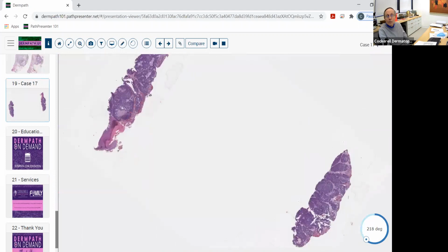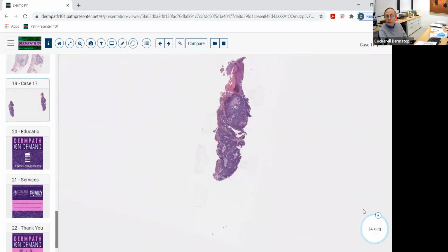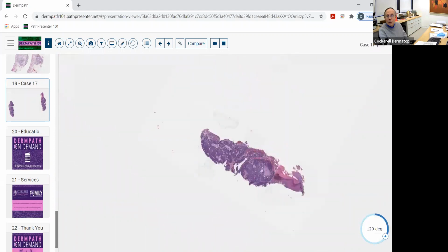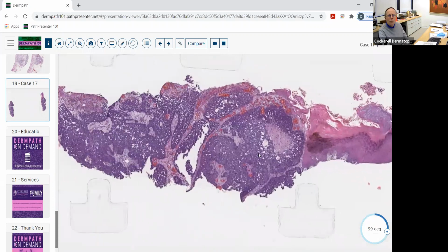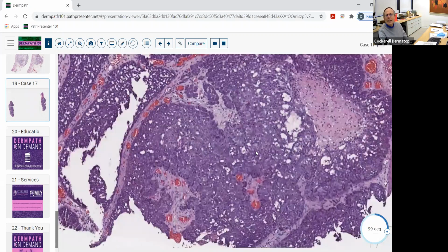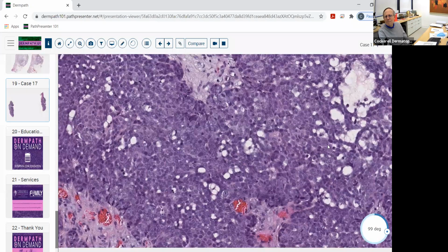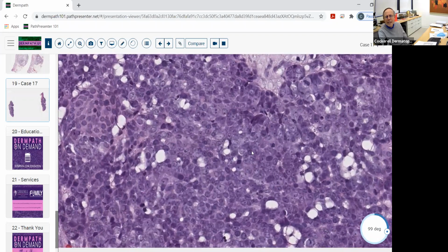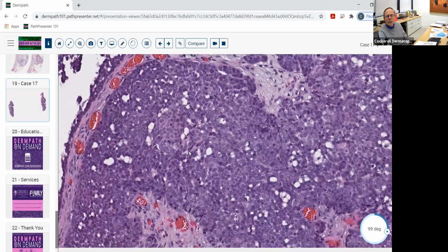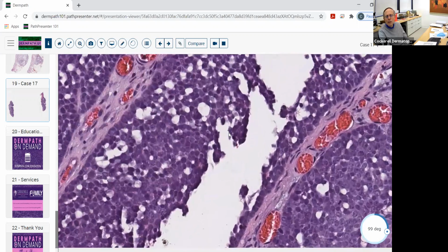Okay. So the last one we're going to look at today is, see if I can get it in the middle of the screen here. Got a shave biopsy and notice that it's eroded, it's ulcerated, it's poorly differentiated. And let's go to higher magnification here. You can see that it's got some ductal differentiation. It's got some cuboidal cells in it. Over here, maybe it's poroid, but now we've got mitotic figures. We've got necrosis en masse in some of the areas. We've got some ductal differentiation.